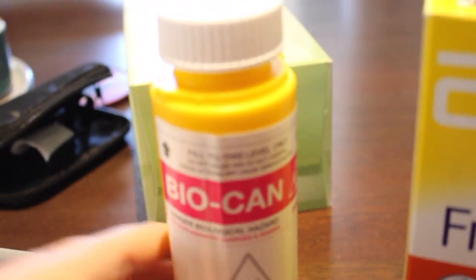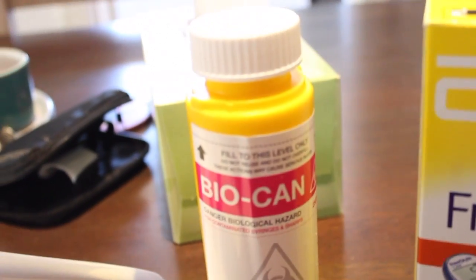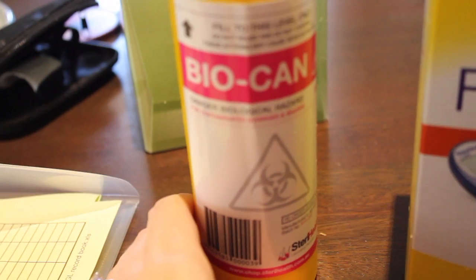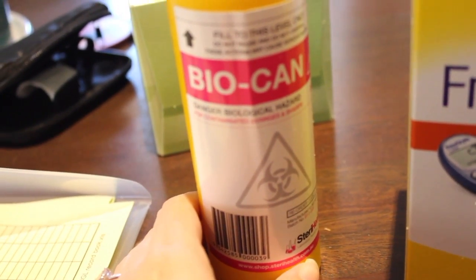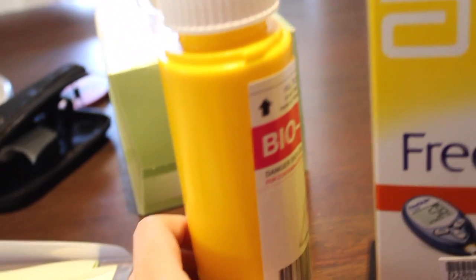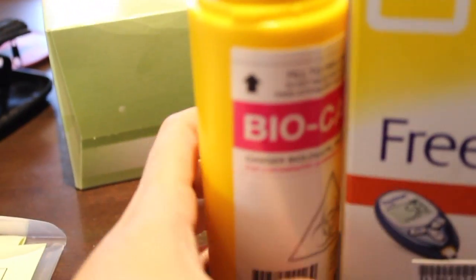Sharps bin. As soon as you start a new day, or you can do it, of course, the night before, once you finish your daily readings, you dispose of your day's used Lancet safely in here, which does not go in the regular trash. Around here, I know you can generally take it to the pharmacy and they will accept it, and then you actually have to buy a new Sharps bin, but that's once it's full, and you can see it's quite a lot of room in here.